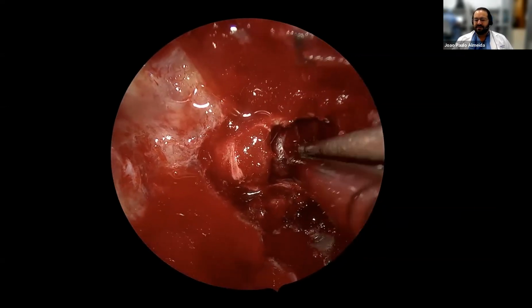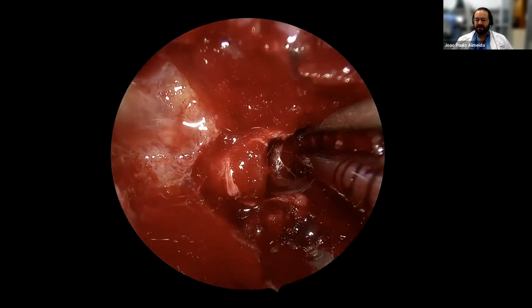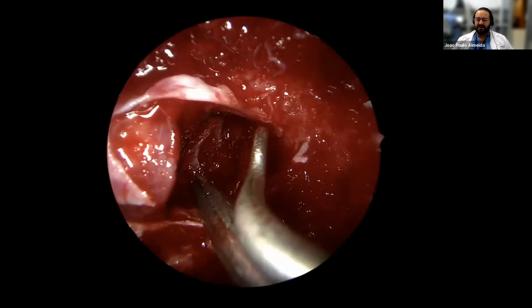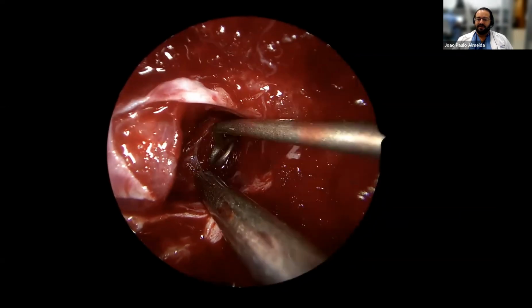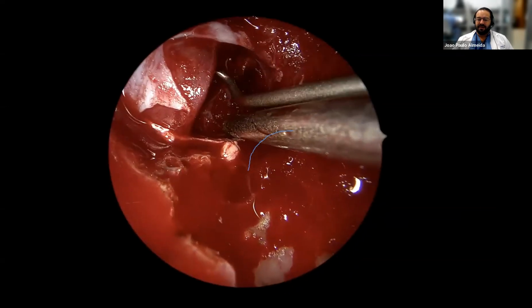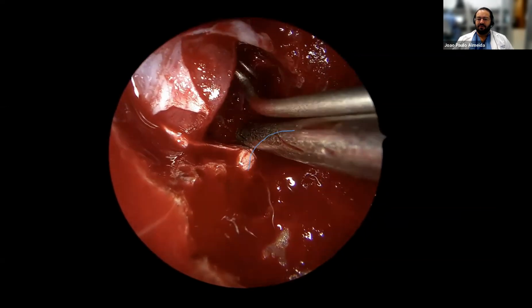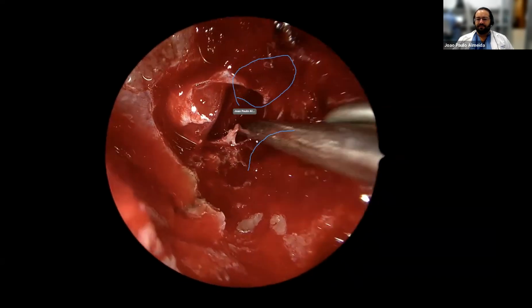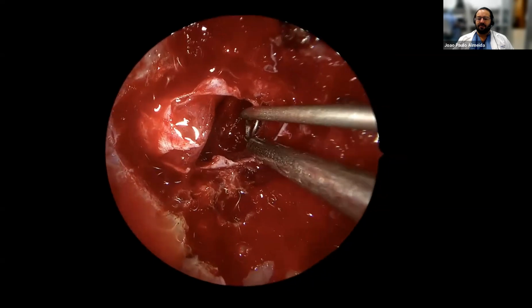So I'm not yet resecting the medial wall of the cavernous sinus. We're just working and then going towards the posterior to the carotid, and that's tumor that you see there. So this is the carotid that I'm retracting here. I'm going medial to the medial wall, so I'm not inside the cavernous sinus, and I'm cleaning now towards the top of the roof of the region of the cavernous sinus as well. But once again, not yet opening the medial wall.